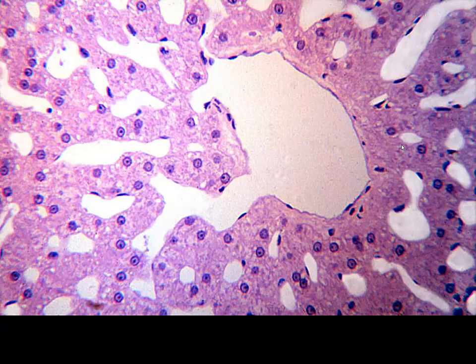Again, we have a different view of our central vein showing the lining endothelium and our hepatocytes. Really, this is a typical H&E stain that we're going to be accustomed to seeing when we look at liver.